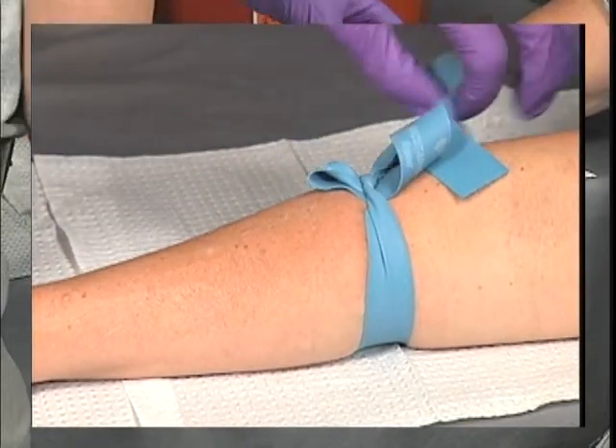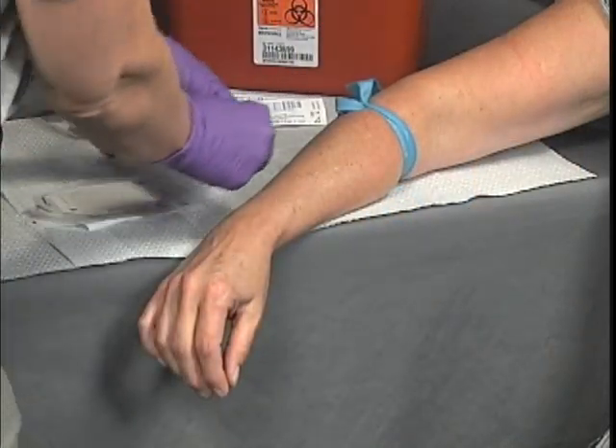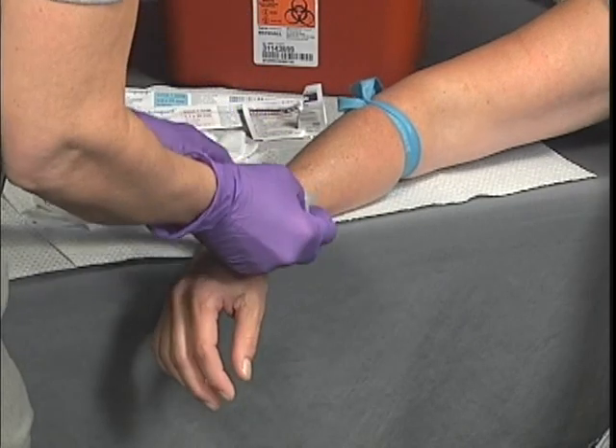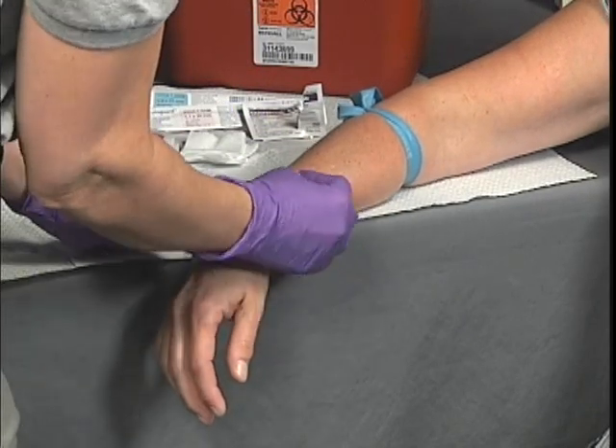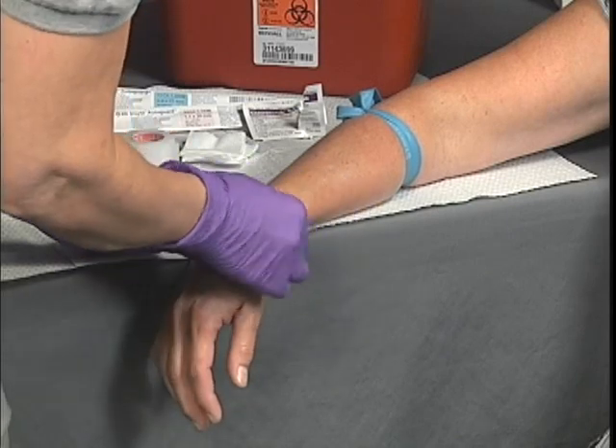Cleanse the intended venous puncture site with a suitable antiseptic swab in an outward motion for at least two inches. Allow the alcohol to dry for 30 seconds for bacteria to be killed and to minimize the discomfort to the patient.